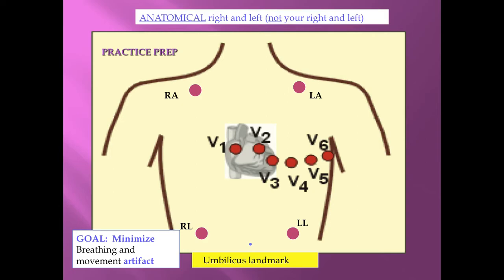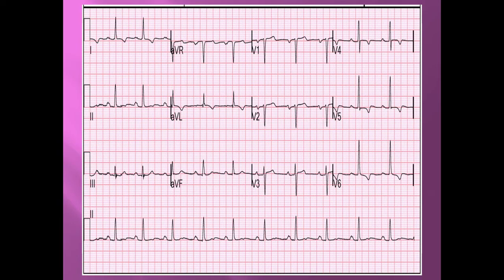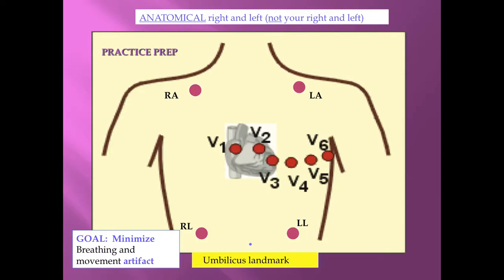All right. So Einthoven's triangle does not include the right leg lead. Let's see. What didn't we talk about in class? So each limb electrode is bipolar, meaning it can hold either a positive or negative charge. This is important because a lead is created by the combination of 2 limb electrodes, with one having a negative charge and one having a positive charge. If electrical activity in the heart is flowing towards a positive electrode in the specific lead, we will see an upward deflection on the printout, like the upward deflection we see in the QRS wave for leads 1, 2, AVL, AVF, and so on.